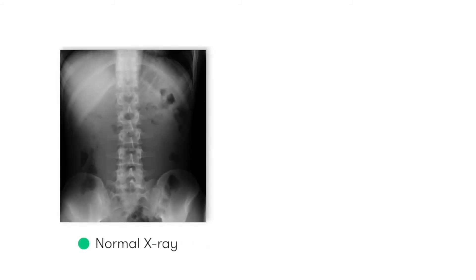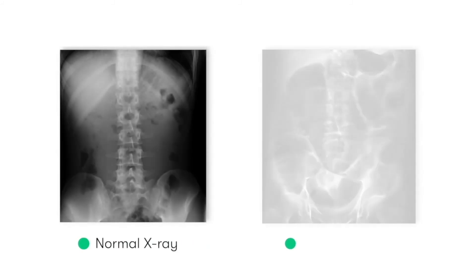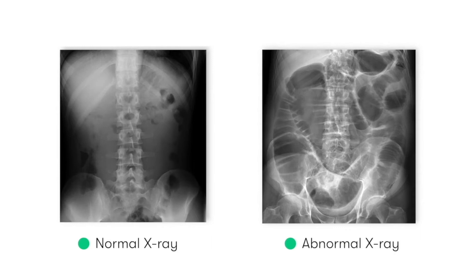Here you can see a normal abdominal x-ray, and next to it an abdominal x-ray that shows large bowel dilatation in keeping with the presence of a large bowel obstruction. It's pretty clear to see that there's an obvious difference between the two.